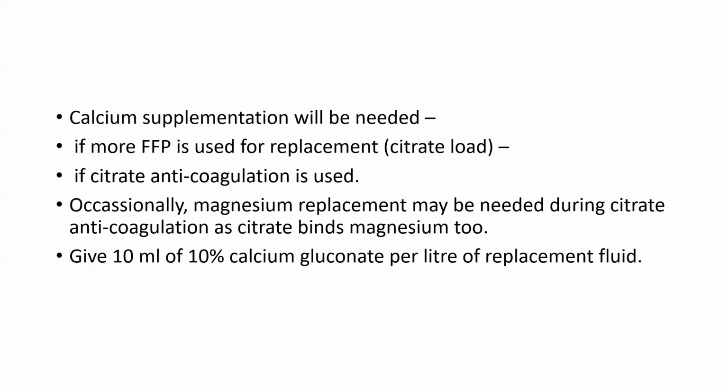So calcium supplement is needed if more FFP is used for replacement, if citrate anticoagulation is used. Occasionally, magnesium replacement may be needed during citrate anticoagulation as citrate binds magnesium too. Give 10 ml of 10% calcium gluconate per liter of the replacement fluid, if you are planning to give this calcium. So a point to remember whenever we are using FFP, we should keep an eye on calcium and magnesium because citrate can cause hypocalcemia as well as hypomagnesemia.